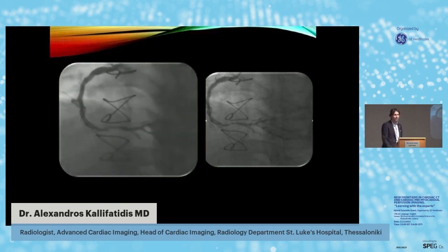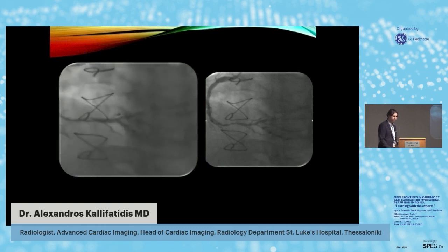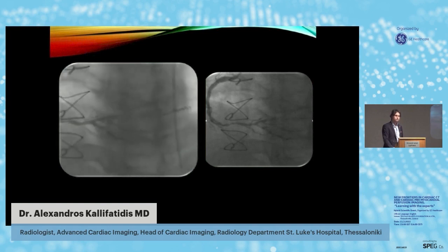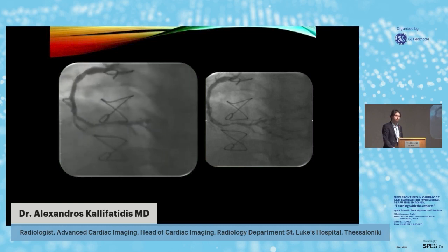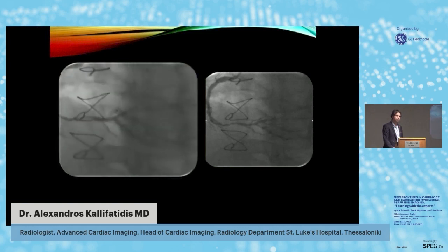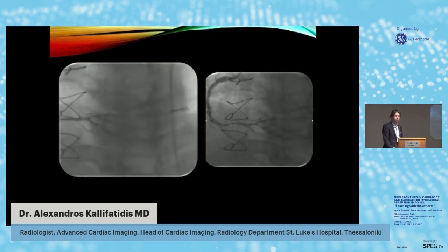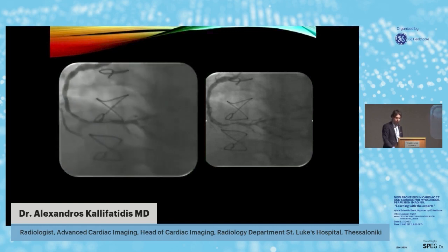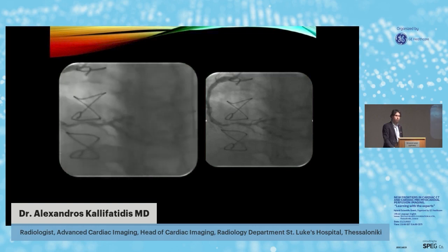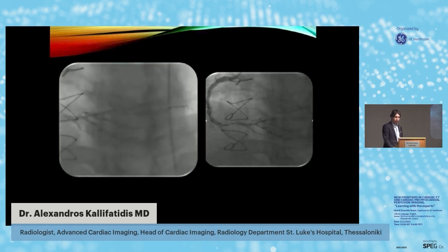Sure, happy to, Alexandros. So basically, what we try to accomplish here is to add the arterial input function in the equation of the perfusion, and in this way we have developed an AI algorithm which has been validated through the NIH with Professor Arai, which shows quite high specificity of the quantification of perfusion, which is not inferior to FFR. This is the first publication which came quite positive for this technique.